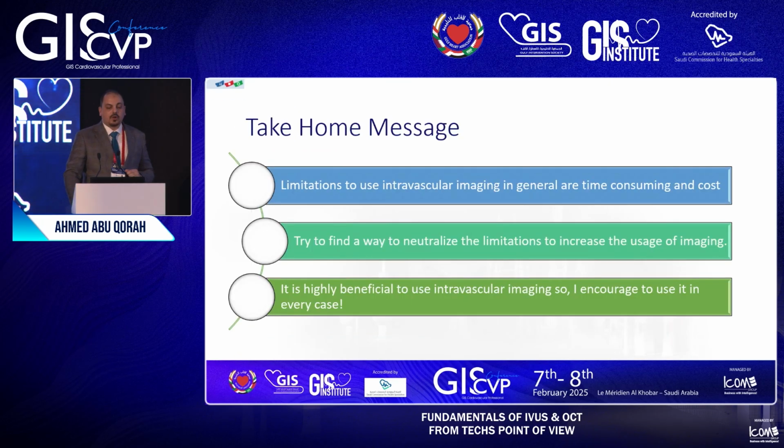And finally, the take-home message. The limitations to using intravascular imaging in general are that it's time-consuming and costly. We should try to find a way to neutralize the limitations and increase the usage of imaging. And from my side, it's very beneficial. It will give you better results. So I encourage using imaging if possible in every case.